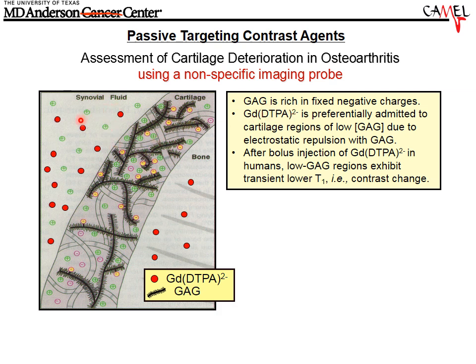So the contrast agent is negatively charged and will then perfuse into the tissue, especially in regions that have low GAG content, because the glycosaminoglycans have a negative charge. In high GAG content areas with a lot of negative charge, the negatively charged contrast agent will not accumulate. And so you can see in this schematic, a lot of agent did accumulate in this low GAG environment.